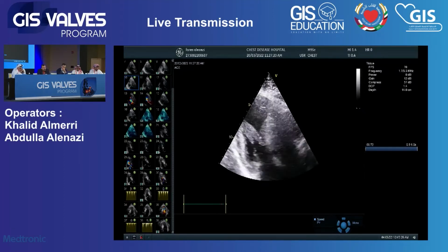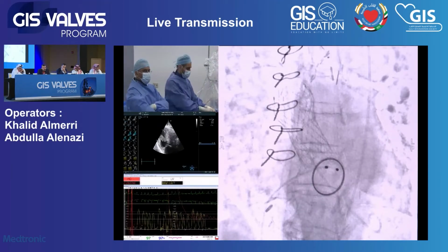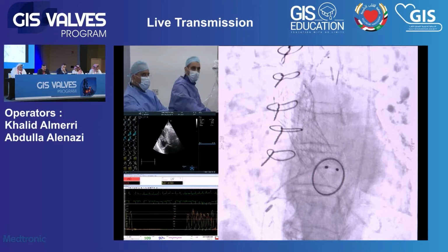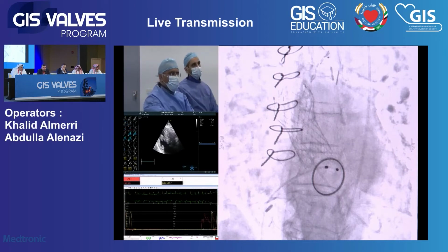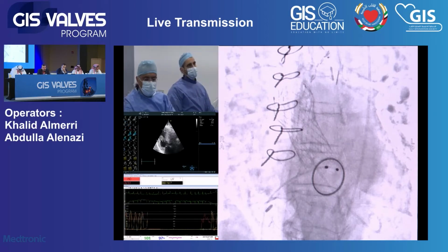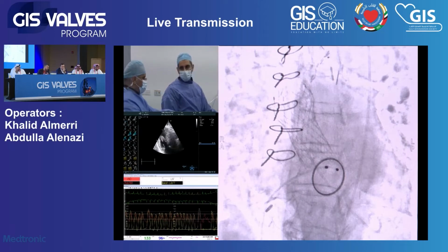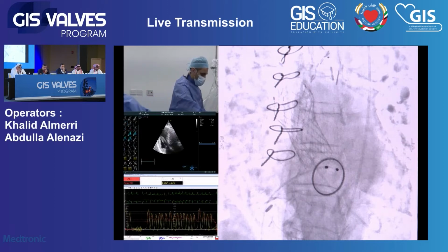One of the things after deploying the valve is the possibility of aortic regurgitation. So we usually take an LVEDP prior to valve implantation and we repeat it after. So if you can remember the first hemodynamics, there was a peak-to-peak gradient of 50, and the LVEDP was around 15. We need to flush the line again.